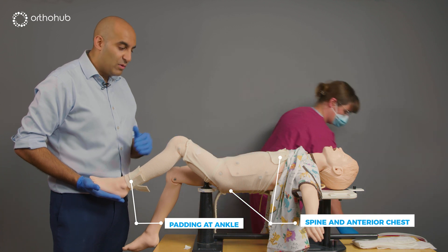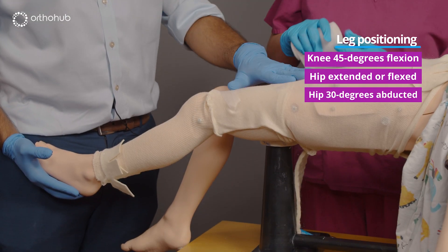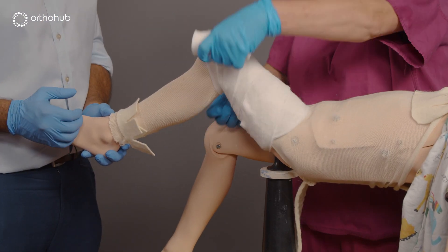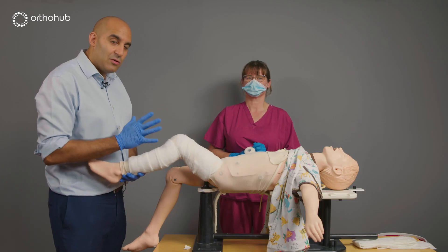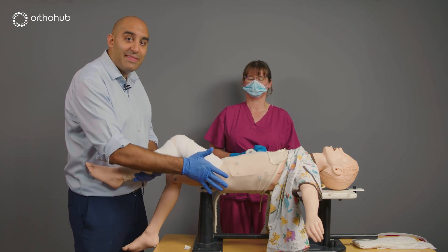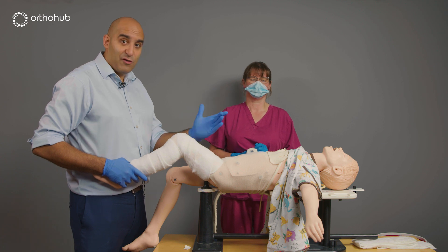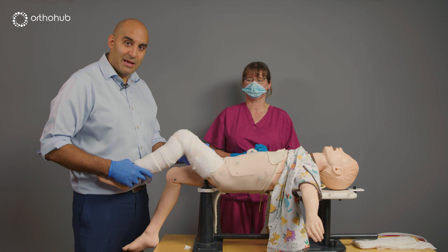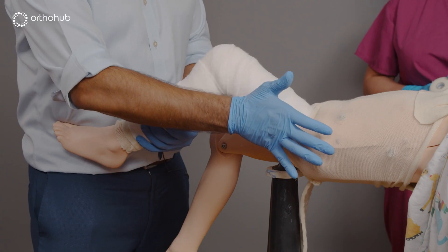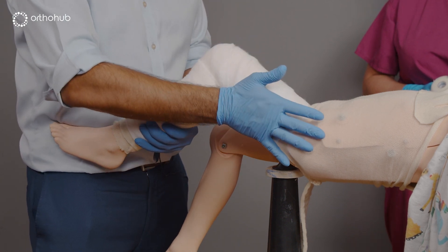You're applying a cylinder cast with the knee in 45 degrees of flexion — this can be done with the hip in incomplete extension if easier. Now with velband in place, ensure adequate fracture reduction. These fractures tend to drift into varus, so the key manoeuvre is to apply a valgus force at the level of the fracture. In theatre with the image intensifier coming in from the contralateral side, under live screening, apply a gentle valgus force and mould your scotch cast accordingly.